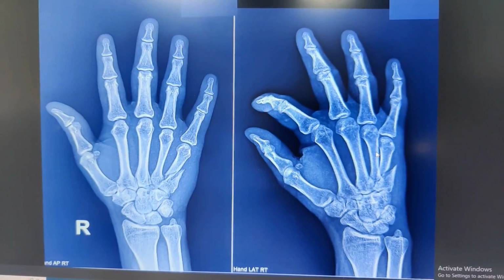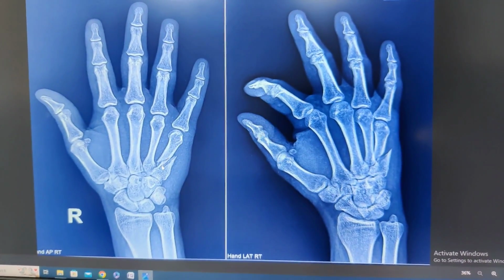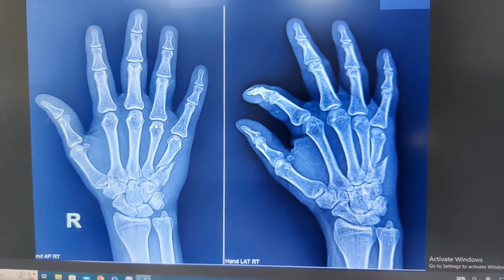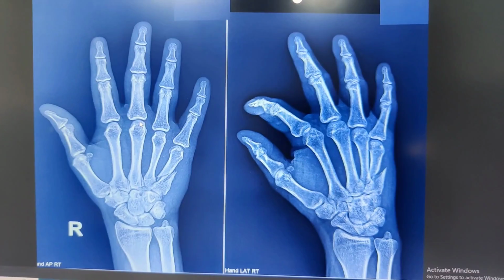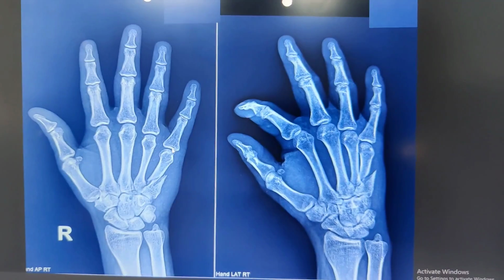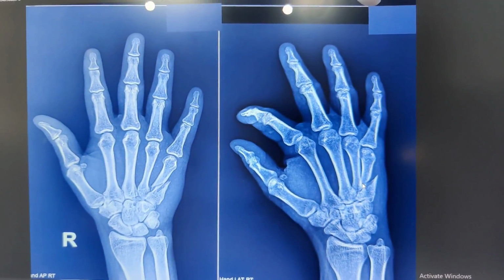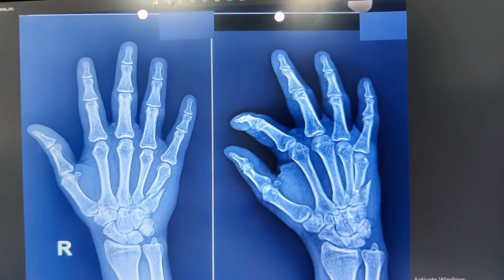This is the X-ray of the gentleman showing an oblique fracture of the fifth metacarpal. There is metacarpal shortening because you can see it's gone proximally. If you see the metacarpal height here, if you see the metacarpal height there, and if you see the metacarpal height here, you can certainly see there is shortening of around 2 to 4 mm. Similarly, on oblique view, you can see a lot of displacement. So today, I will show you how to address this fracture using transfixation technique with K-wire.